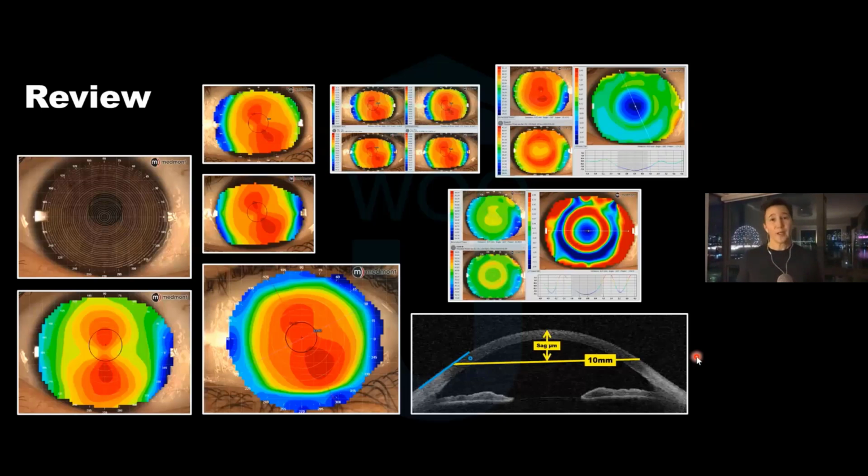So in review, what we want to make sure that we do to partner the best way possible with wave is to ensure that we've got good coverage. Get that patient to open up as wide as possible. When you look at that reflection, those rings reflecting off the eye surface, do we see any breakups? Are there distortions or warping of those rings? Let's get our patient to blink regularly. If that doesn't do it, put in artificial tear, try to smooth over that reflection.